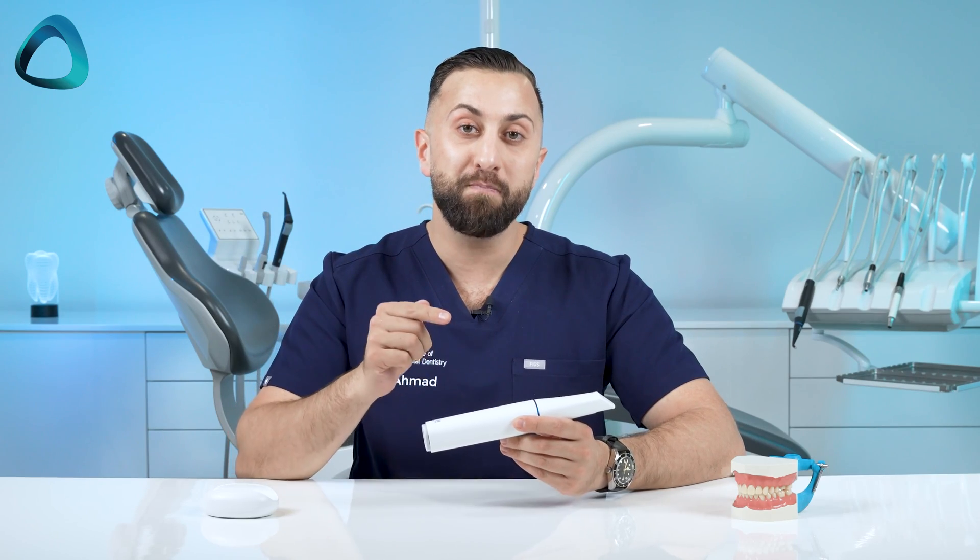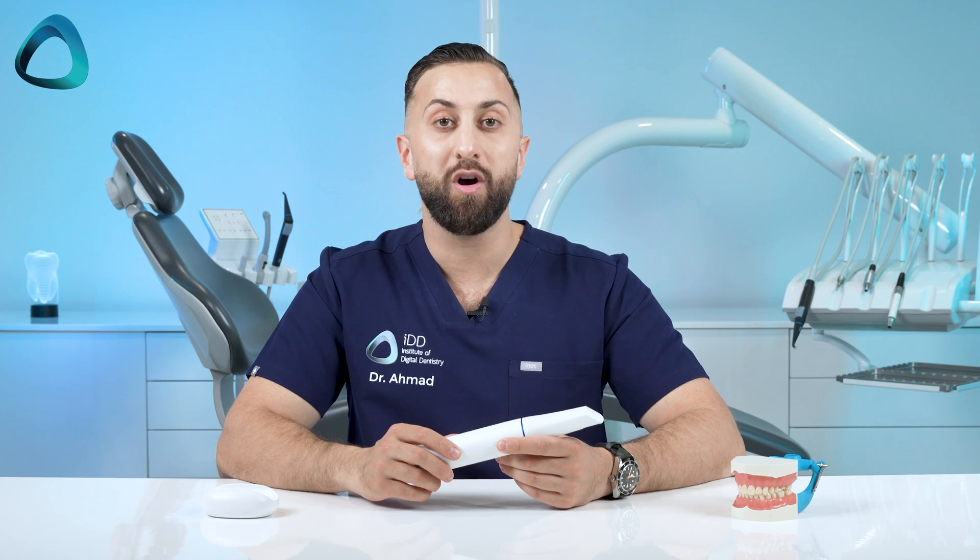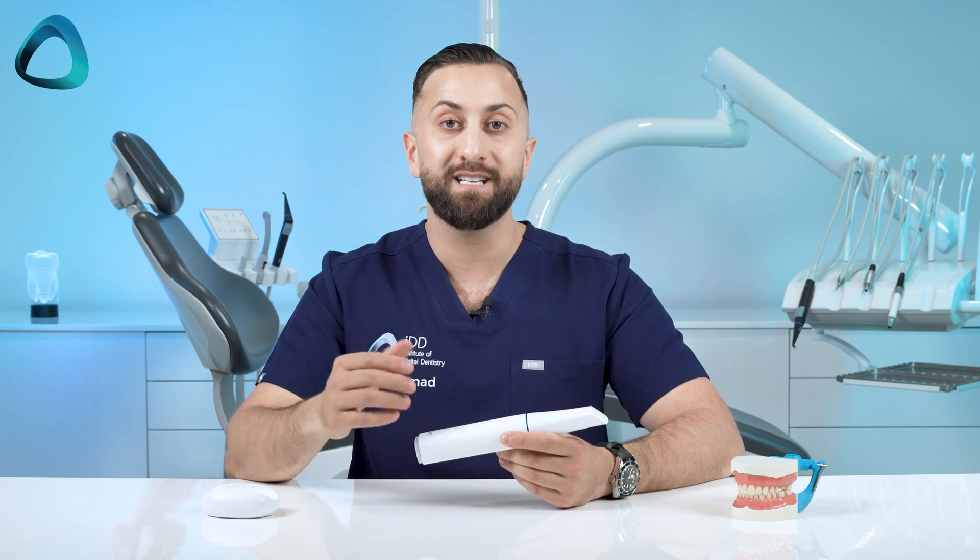The Medit i900 is the company's fourth intraoral scanner and it's built with their third generation new optical engine. The technology delivers super clear images and true-to-life colors, making easy work of any scanning task and the various environments within the oral cavity, such as reflective metals. The i900 also has improved scanning depth, ensuring every detail is captured with ease.